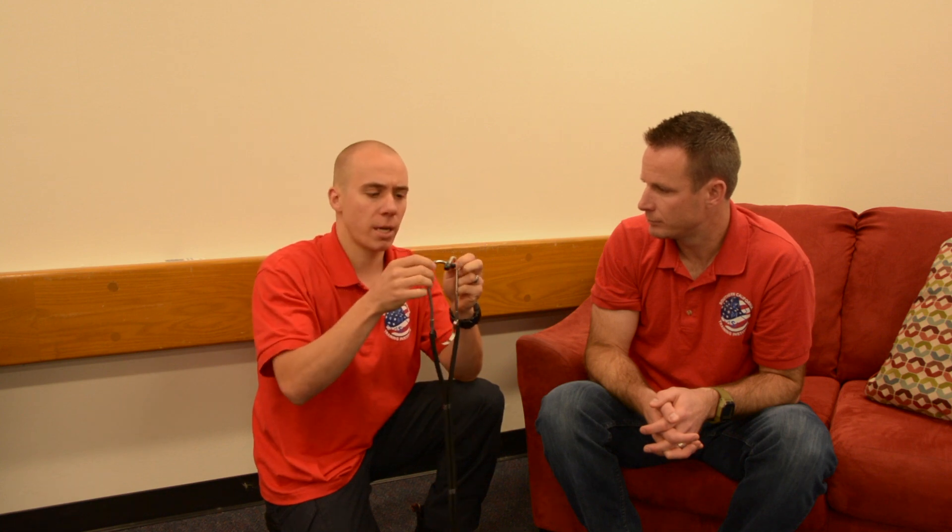A few things on the stethoscope: when you're listening to a blood pressure, always make sure the ear pieces are facing towards your nose. If they're backwards, you won't hear anything — you want them facing forward into your ears. When you put it on, gently tap it to test which side the bell or diaphragm is active, because we're always going to use the diaphragm side. And don't put the earpieces in until you're actually ready to listen, because having them in while things are bouncing around will hurt your ears.